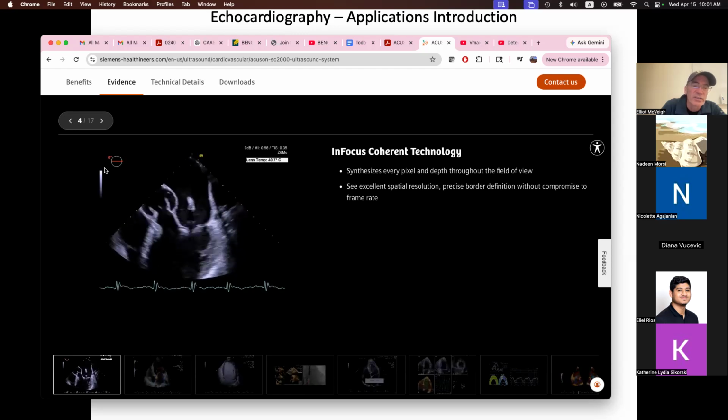Oh, this is gorgeous. So here you can see, well, one thing that's clear here. If my transducer's up here, I'm not actually sure where this transducer is because I believe this is an intracardiac catheter in focus. Maybe it might not be.